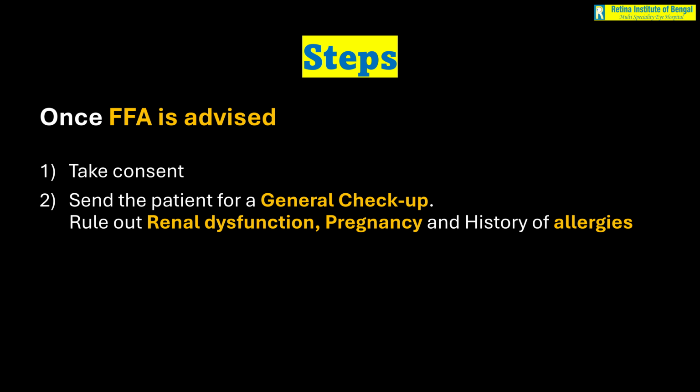But there is a lot of controversy around it. Some say that this subcutaneous test is actually not very practical. It doesn't really rule out the possibility of anaphylaxis once you inject the dye intravenously. Some also say that if a patient is really sensitive to the dye, even the subcutaneous injection can also cause a reaction. So that itself is also risky.